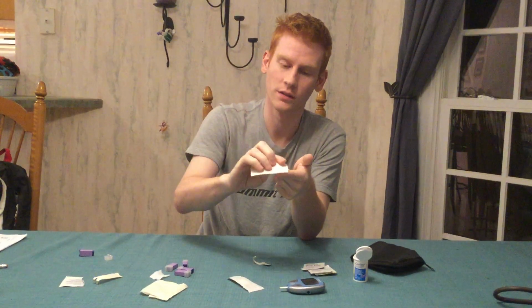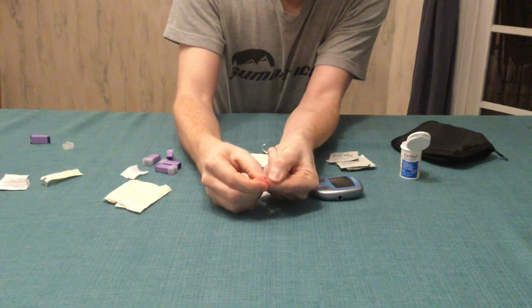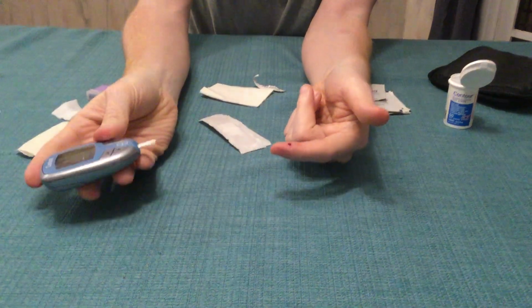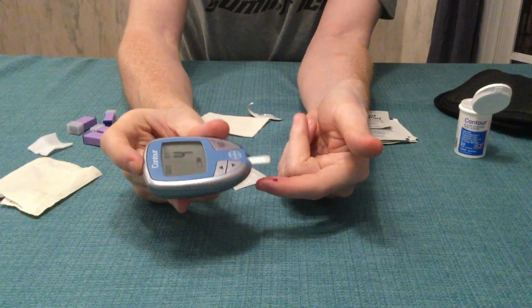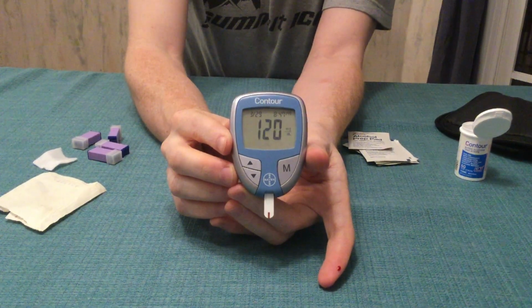All right, so I cleaned it off. I'm going to prick the side of my finger, 1, 2, 3. Ow, that really hurt. So that will go into a sharps container. I'm gonna wipe away the first drop of blood. And then if you don't get any blood, which is really hard to see on me because I'm not getting any blood, you can kind of milk around and get a good drop. All right, so that's a plethora of blood for a glucometer stick. And then I'm gonna approach the bottom of the strip, and it will tell us what my blood sugar is.